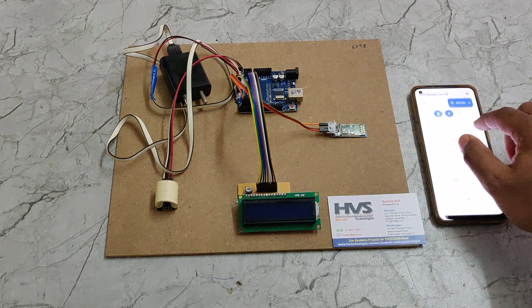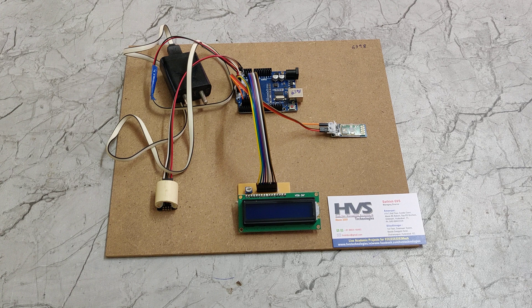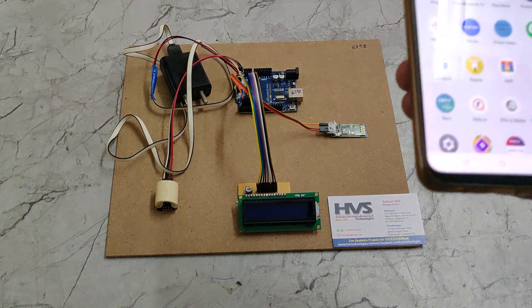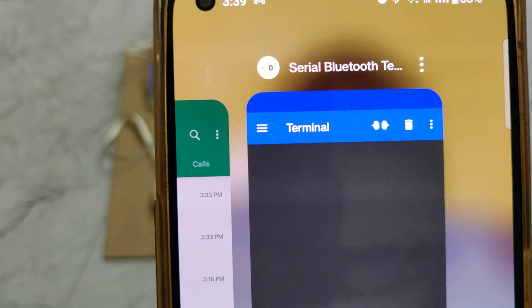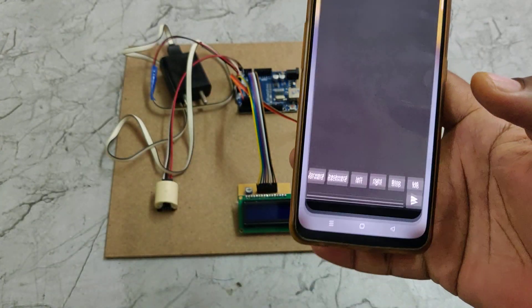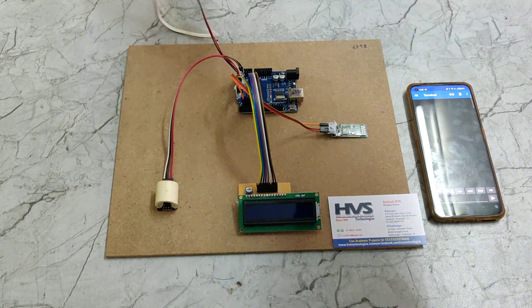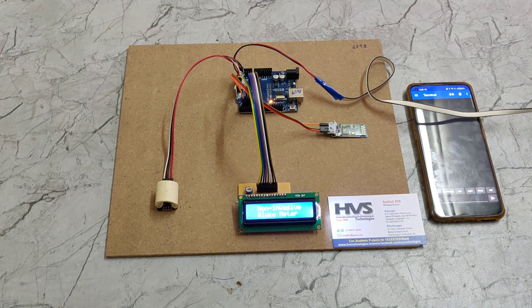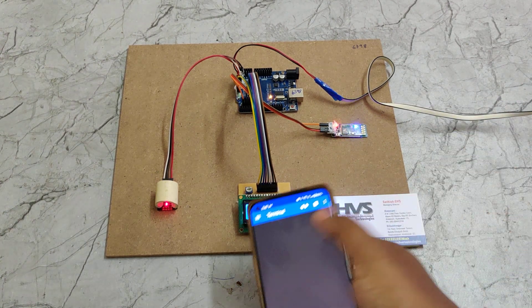The same data is also sent to the mobile phone through Bluetooth using the HC-05 Bluetooth module. Before the demonstration, the first step is to install the application available in the Play Store for Android mobile phones. The application we need to install is called 'Serial Bluetooth Terminal.' After installation, you can power on the device and a welcome message will be displayed on the LCD screen.